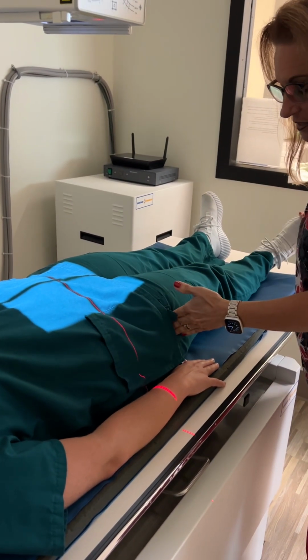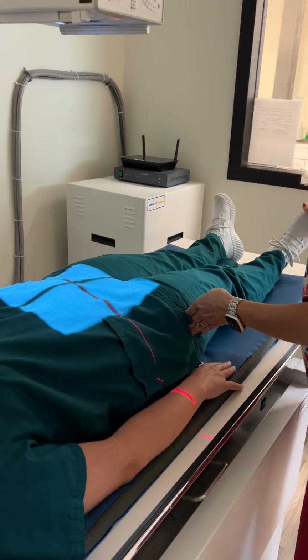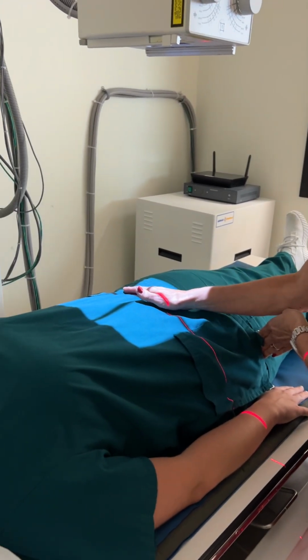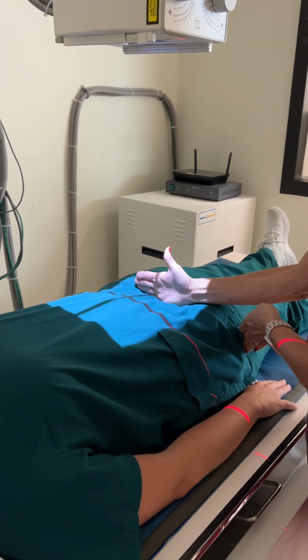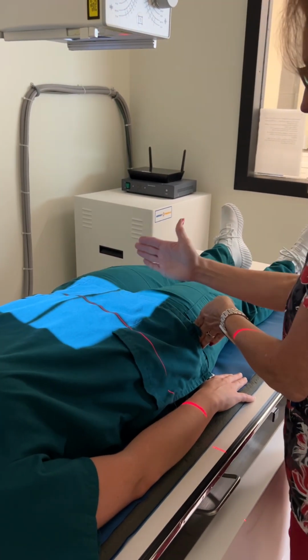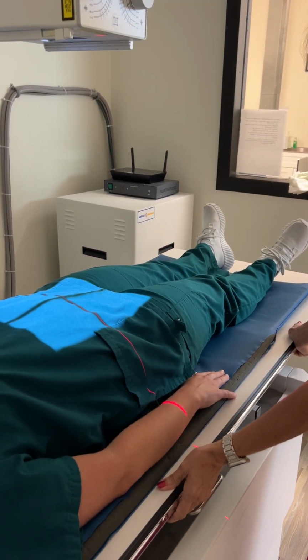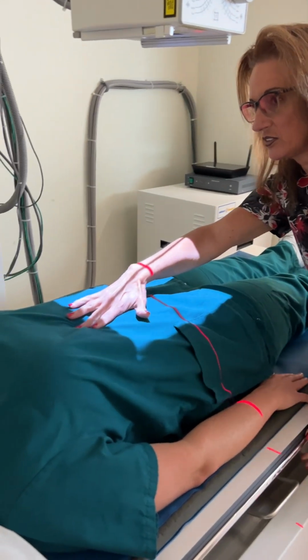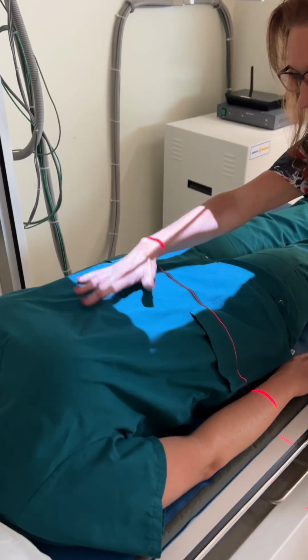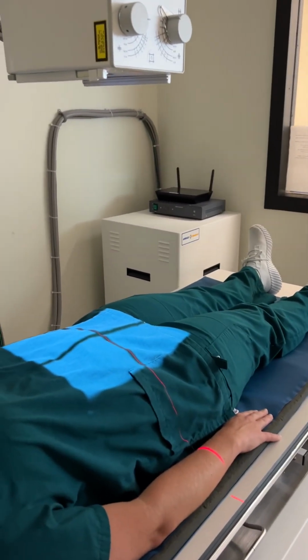So I'm gonna palpate the patient's greater trochanter, which is right here. And then if my patient's okay with me touching her, I'm gonna palpate pubic symphysis, which is right here. And I need the bottom of the light field to include that area. So I'm gonna come up just a little bit. Make sure I'm in the center, which I'm good with that. I'm gonna have her stay like this, and I'm gonna grab my marker.